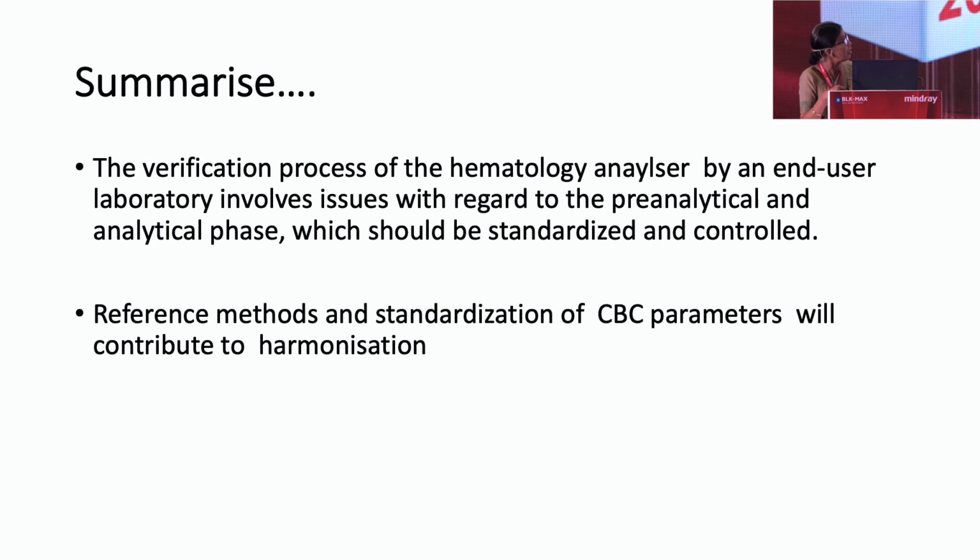So to summarize, the verification process of a hematology analyzer by an end user laboratory involves issues with regard to the pre-analytical and analytical phases, which should be standardized and controlled. Reference methods and standardization of CBC parameters will contribute to harmonization and more reliability on the results generated by the auto analyzers for clinical practice. With this, I conclude the session.